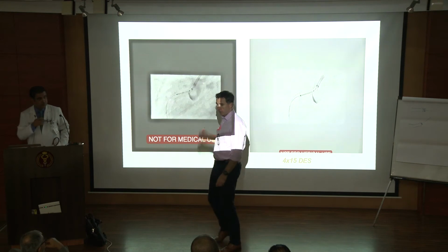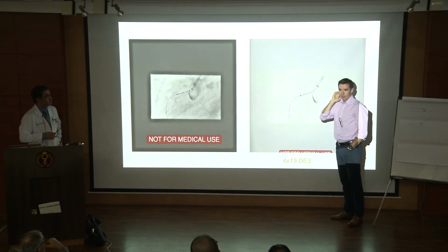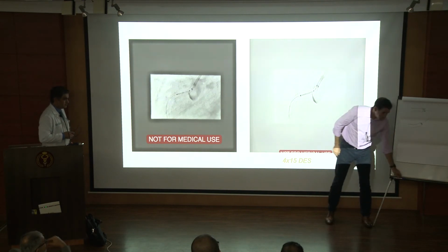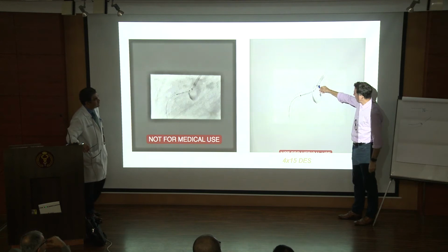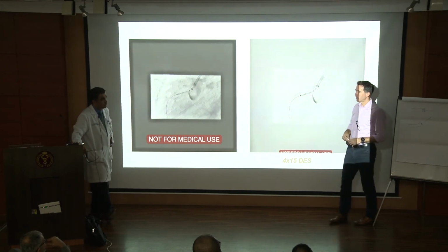But I think you're better putting the stent into the aorta. So let's say for example this stent is now here and it's 5 millimeters into the aorta. How do you solve that scenario?